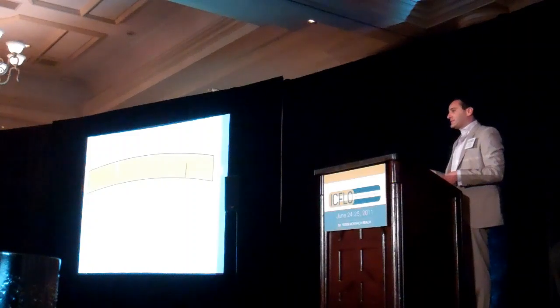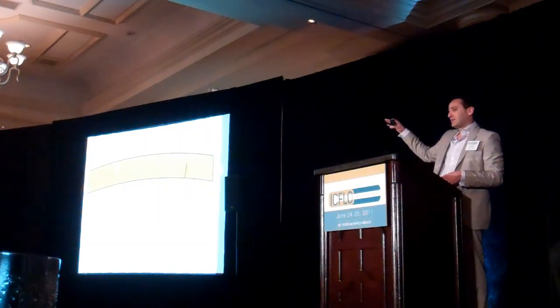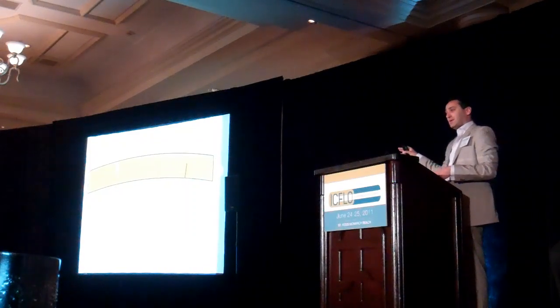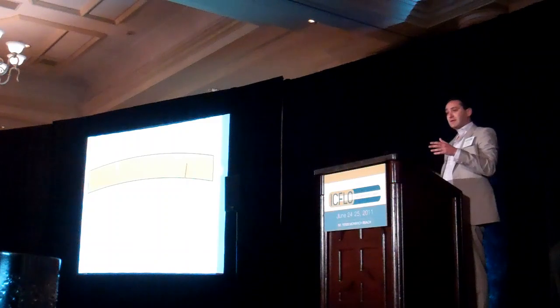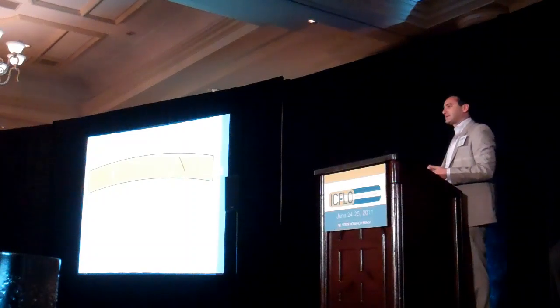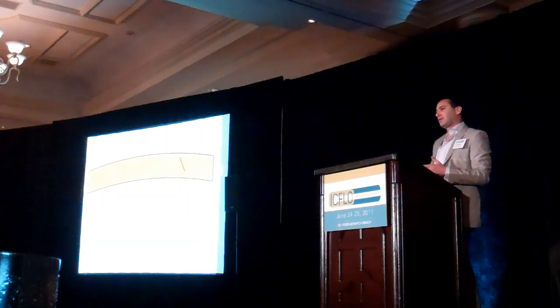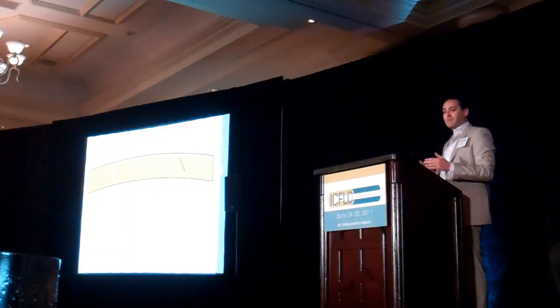Depth in the stroma. Now, this is the idea that we might be able to pair incisions, and one may be anterior, and one may be posterior, and this may actually result in steepening in one axis and flattening in another axis, depending on what we need for the patient. And then we come to this idea of what about the side cut angle? So when we look at our LRI current nomograms, we account for age, we account for PK versus cataract surgery, natural astigmatism. But what about the ability to change the angle?